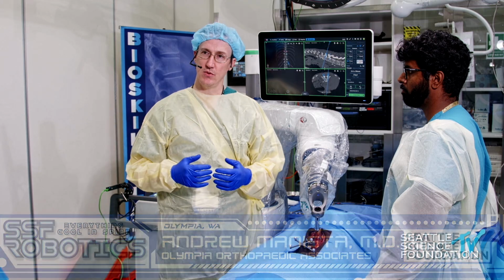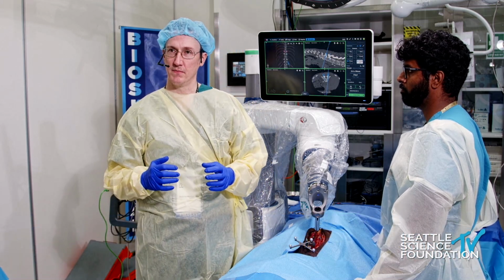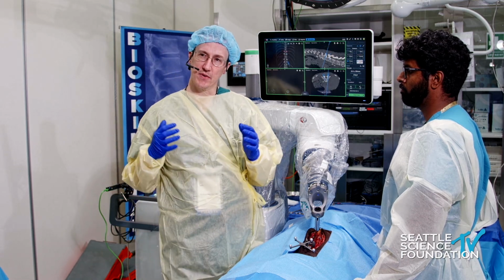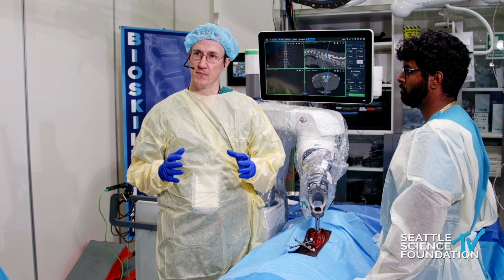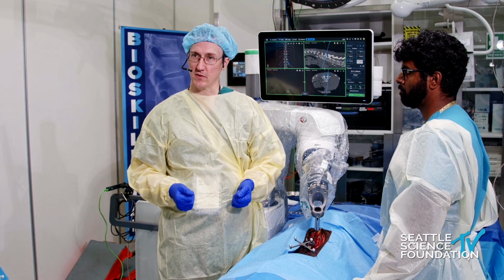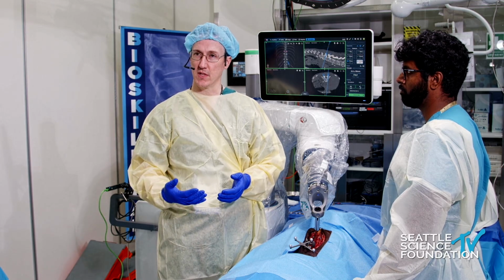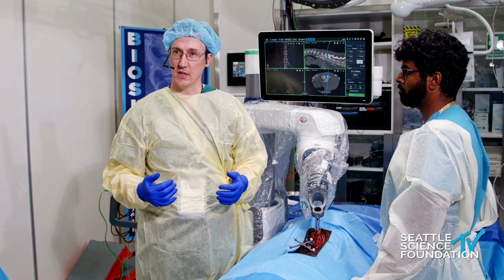What does seem to make a huge difference is engaging the best bone you possibly can. And so I have the philosophy of, if I'm going to stick screws into osteoporotic bone, I think of it as room temperature butter, and I'm putting toothpicks in it. If I'm going to lift this off the plate, I need as many toothpicks as possible. So I will frequently add more levels of instrumentation to an osteoporotic person so that I have more purchase overall.